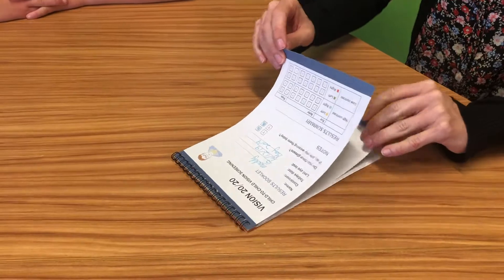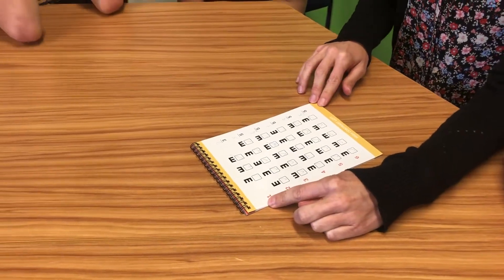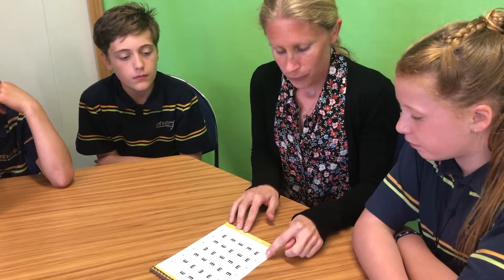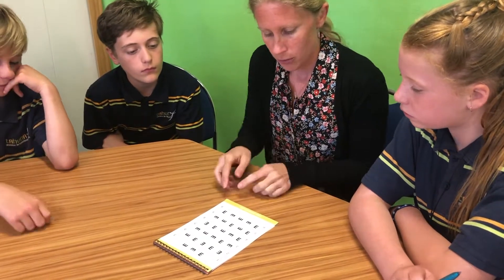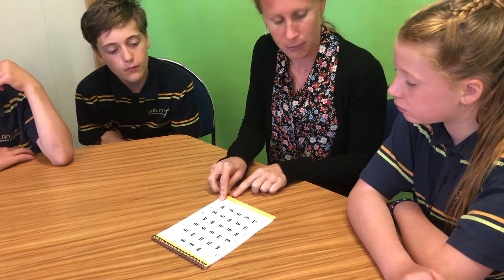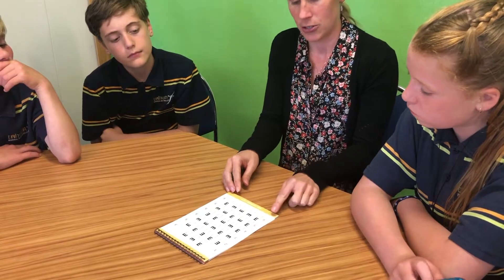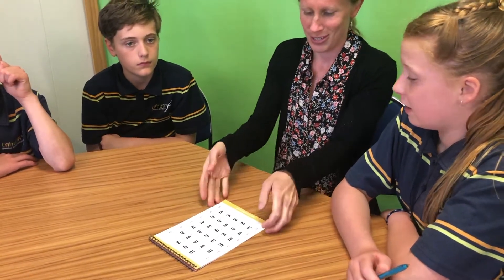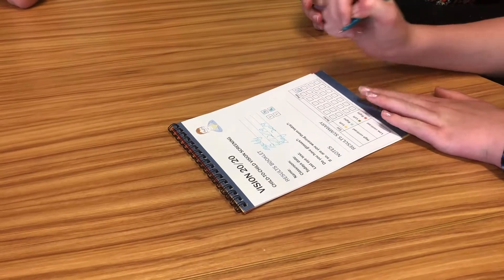So you've added up all the numbers. This is the easiest test — the biggest letters. This is the hardest test — the smallest letters. Your final score is the number of the hardest row that you got more than half right for. There are five letters in some rows, so more than half means three ticks or more. We start at the bottom of the chart because that's the hardest. For row number six, how many ticks did you get? Five. So what would that make your score? Six. Good job. Now go back to the first page — this is the yellow one — and circle six in the yellow chart, because that's your score for that chart.